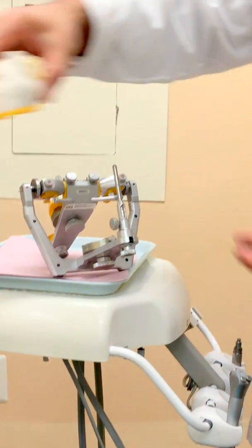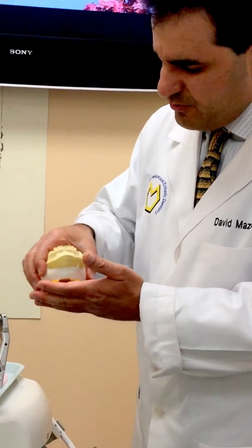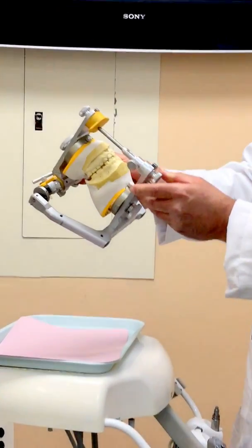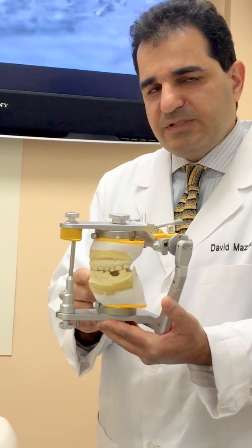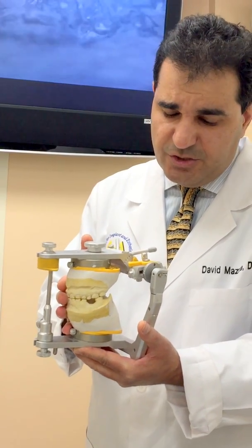We have already mounted the mandibular cast based on the maximum intercuspal position bite registration. I'm going to bring it together and make sure everything is on zero. We also have another mounting in centric relation, but in this case just the maximum intercuspal position is going to be used.